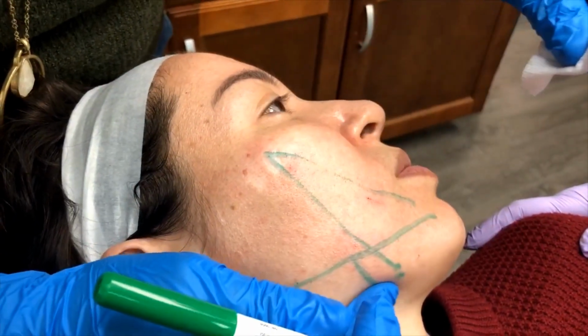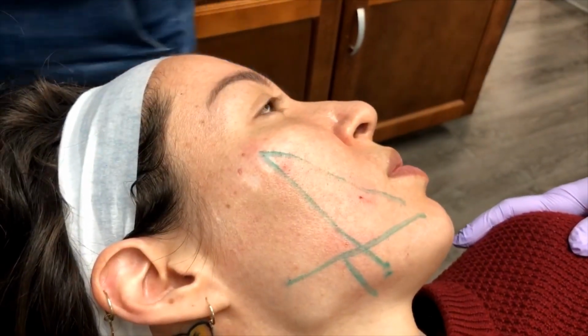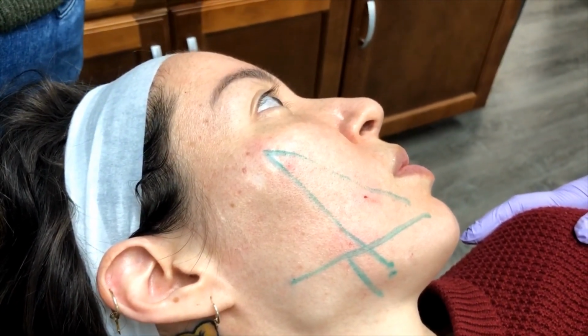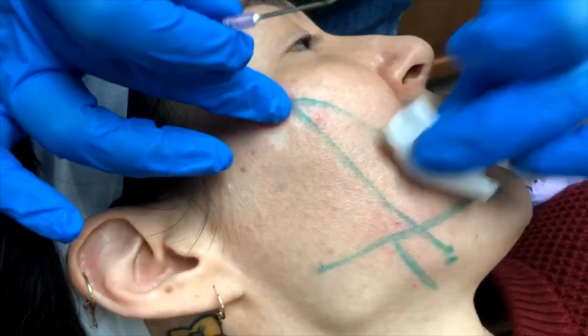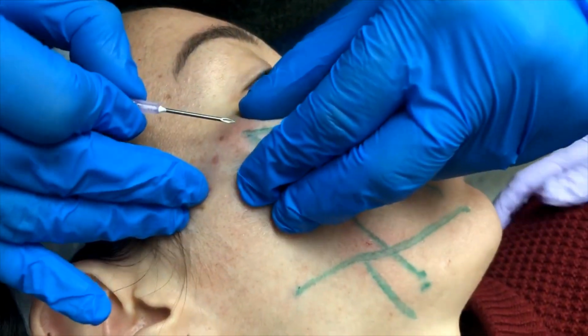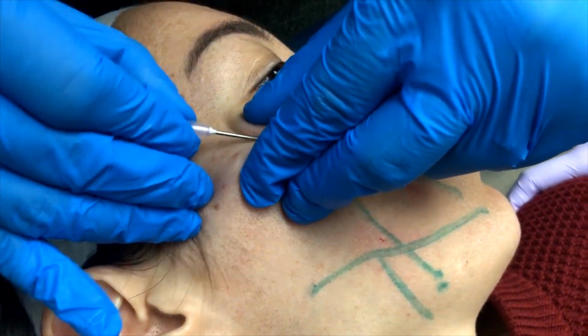We want to be careful and stay away from that point, even though we are going to be superior to that. But you always want to know where your anatomy is at every single time. That is what is super important. Now we are using an 18 gauge pilot hole needle, and we are feeling for our landmark. We want to know exactly where we are. We're going to be around the zygoma, right on top of it, and we are going to place this now.